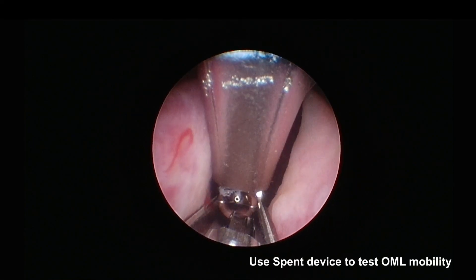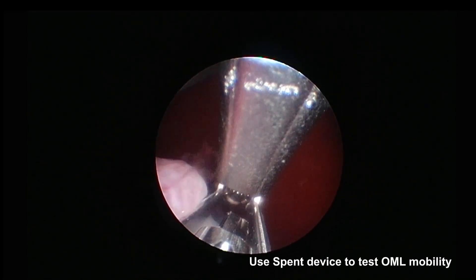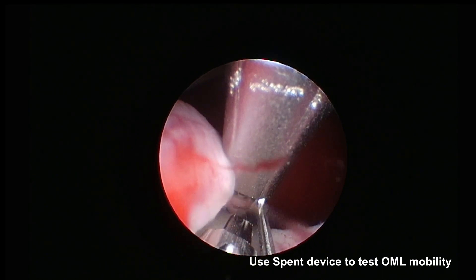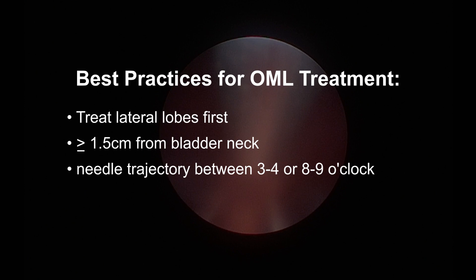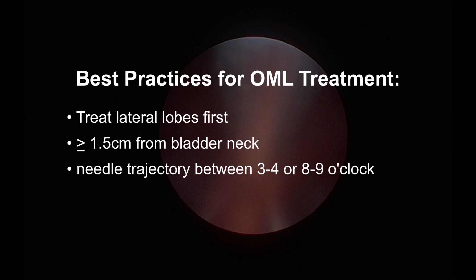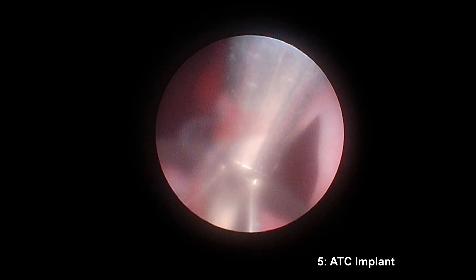Next, I exchange the scope seal for a spent UL-2 implant cartridge in the delivery handle and test the mobility of the OML. Best practices for OML treatment include treating the lateral lobes first, targeting implants at greater than or equal to 1.5 cm from the bladder neck, and the needle trajectory between 3 to 4 or 8 to 9 o'clock to avoid the neurovascular bundles. The ATC wings help immensely in engaging and controlling the OML tissue, while the needle location markers help with needle targeting. After I determine the direction of mobility, I switch to the ATC device.